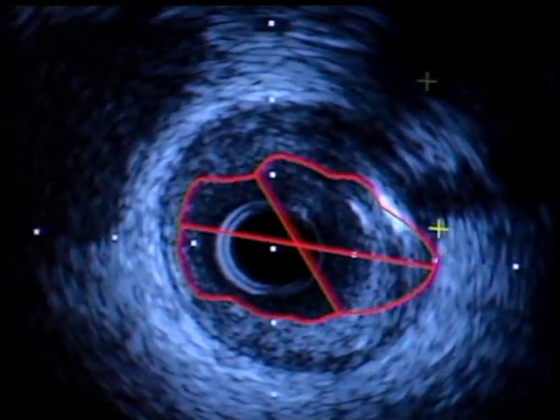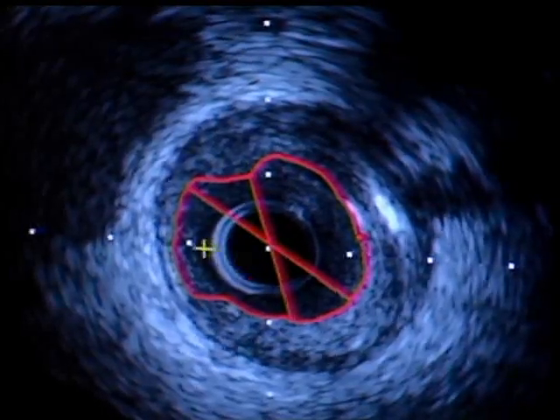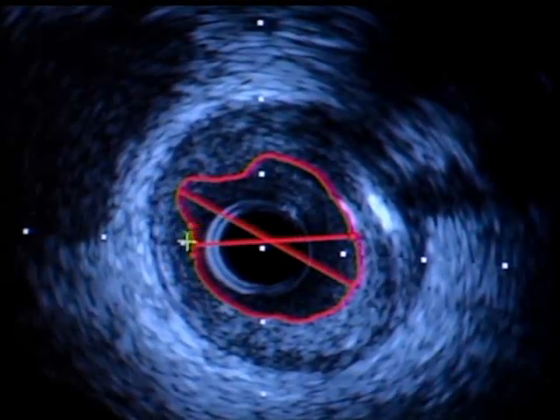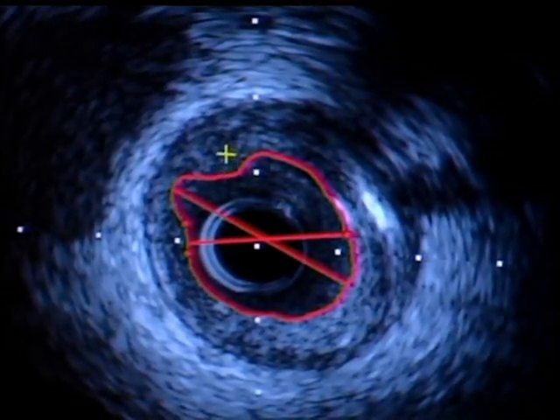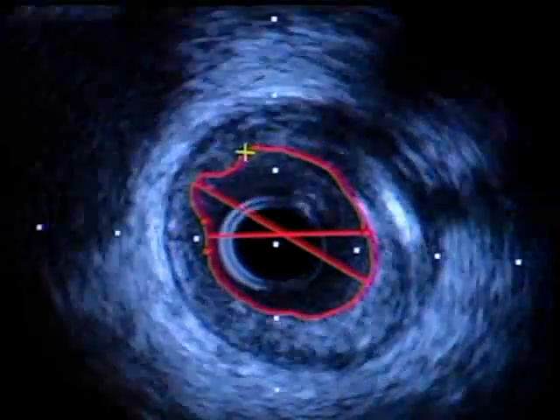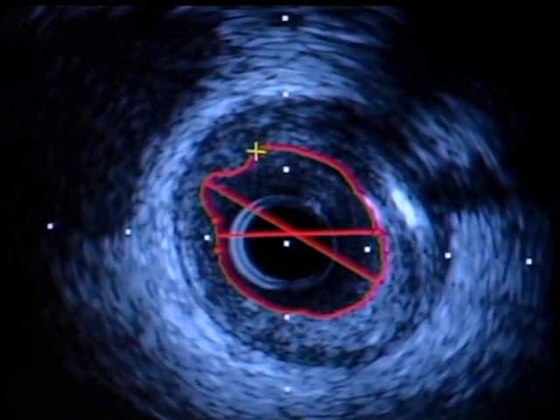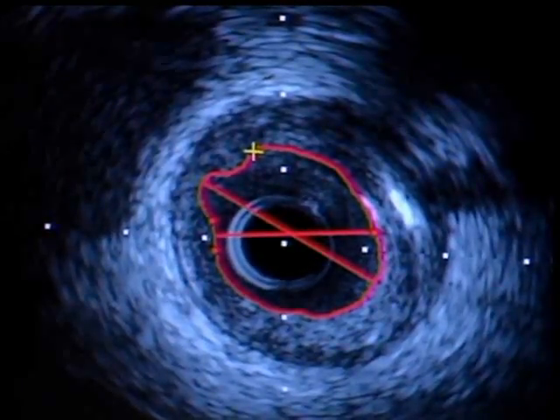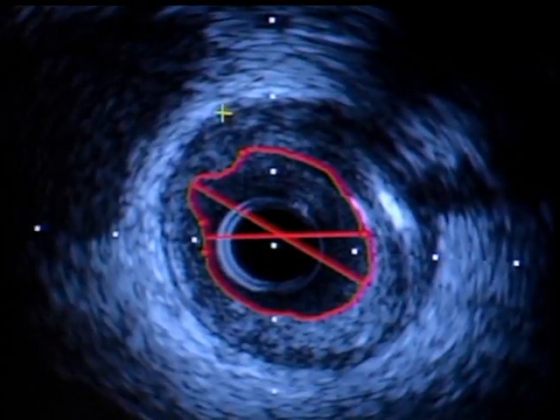Let's calculate that. This is the area which, if you see on the angiogram, I'll point it out, is very hazy appearing. And why? Because of this plaque. Look at the plaque burden. Good. This is barely 3.8 millimeter square, with an area of 3.8. And what is the plaque burden total? It's probably 60%. So this is that area.